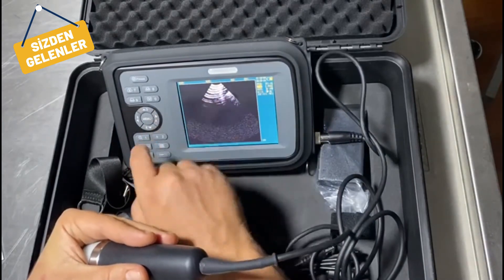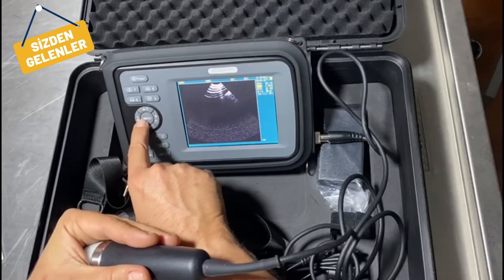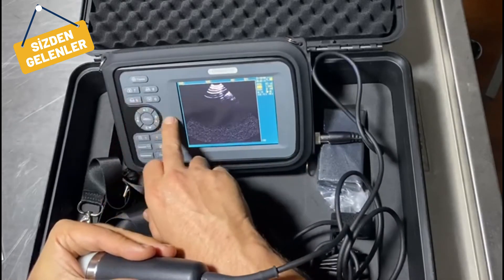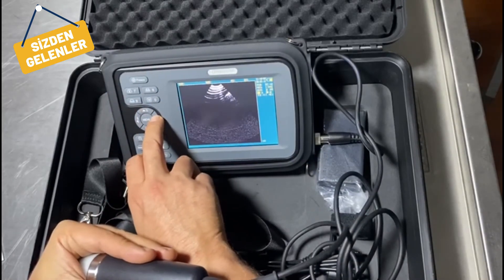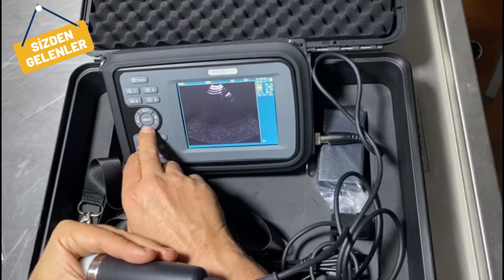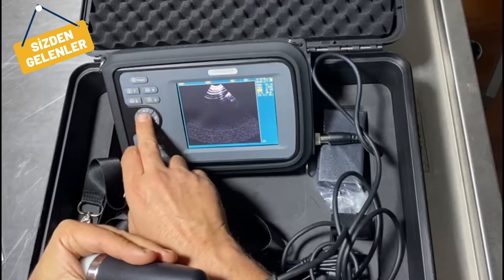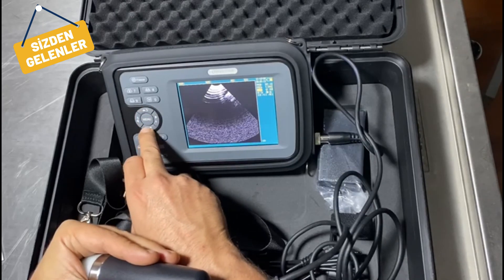In here you can choose the frequency. With the four and five buttons you can change between options without unfreezing. You can go for frequencies of five, two point five, and three point five. You can also increase or lower the gain.